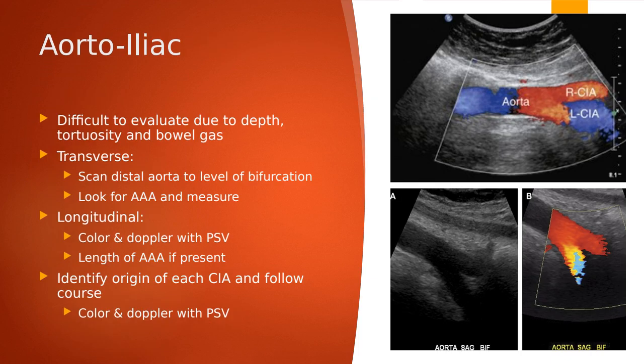So kind of just going through, we know how we should be scanning an aorta. We know what we're looking at. With this, like we said, we're taking it down further into the legs. So we really want to make sure we're doing a good evaluation of the right common iliac and the left common iliac from that bifurcation. We're still looking for aneurysms. We're still looking for dissections. We know how to document those things. We know how to document a AAA or an aneurysm of any type. So we're following what we know, and then we're taking it a step further down into the leg.